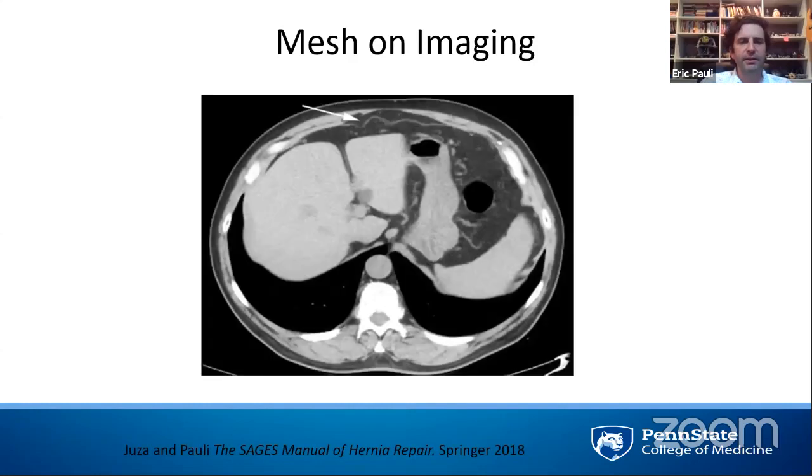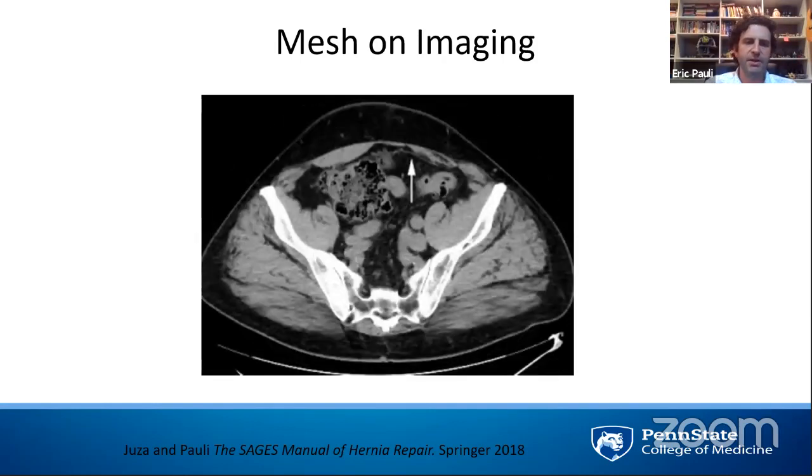So how do we find them? Let's take a look here. This is a patient who had a laparoscopic repair, okay? What we can see from this is a non-anatomic wrinkle in the upper abdomen. I can also tell you there really shouldn't be anything here. This is not the peritoneum, okay? You have fat above it that was not stripped off of the rectus abdominis muscle. This was just put against the falciform ligament, and you've got some omental fat below it. And lo and behold, what is missed by radiology or maybe thought just to be the peritoneum is actually a piece of laparoscopically placed mesh.